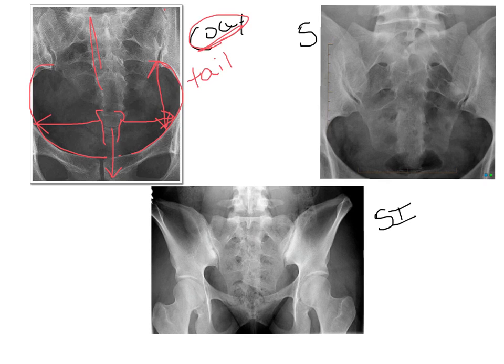And we have more space on this side from here to here than we do on this side. So there is some slight rotation, but it is so slight, and we do get a clear view of the coccyx, not superimposed by the pubis symphysis. So this would not be a repeatable error, this slight rotation.